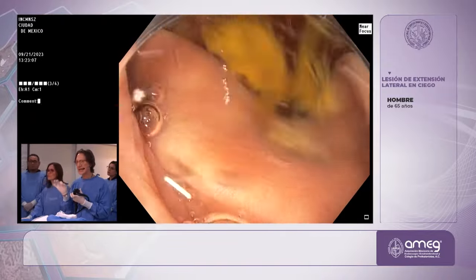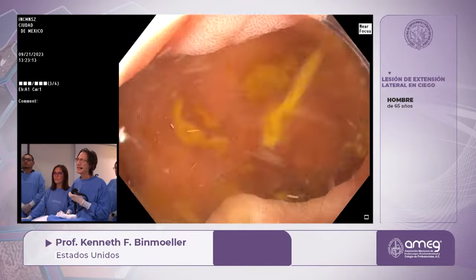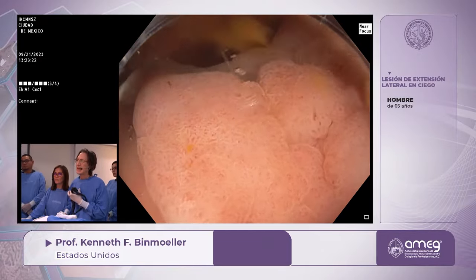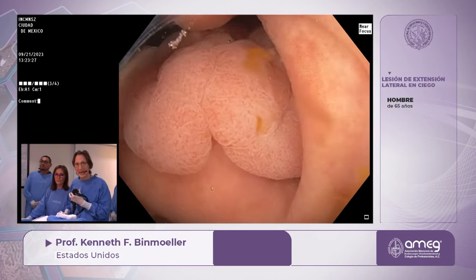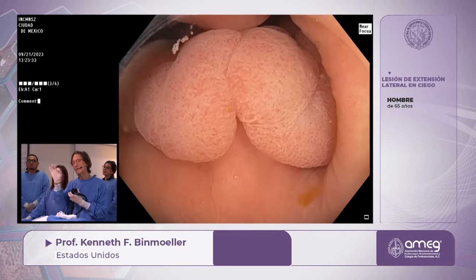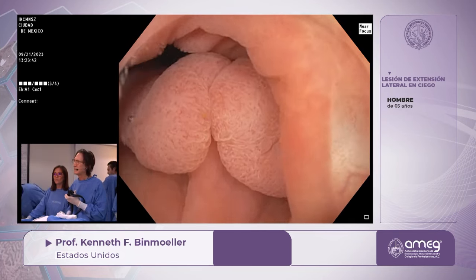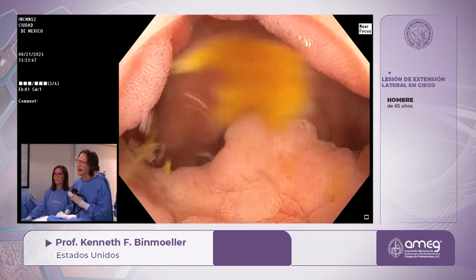The term sessile should only be used with polypoid lesions. That is to say, lesions that are 1S. So this would qualify as what they call a sessile lesion. An elevated lesion is a lesion that is a Paris II classification, and it is just elevated. So it's less than 2.5 millimeters if you use the closed biopsy forceps. That's 2.5 millimeters. So that's how you make the distinction between sessile and elevated. So this is a sessile lesion, 1S type.